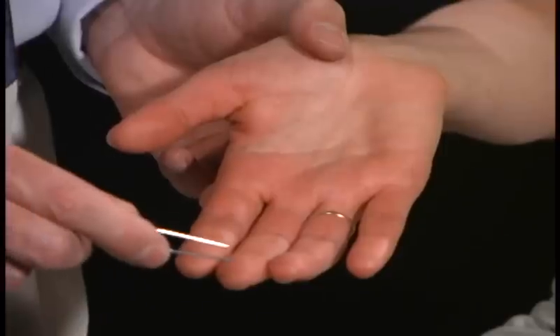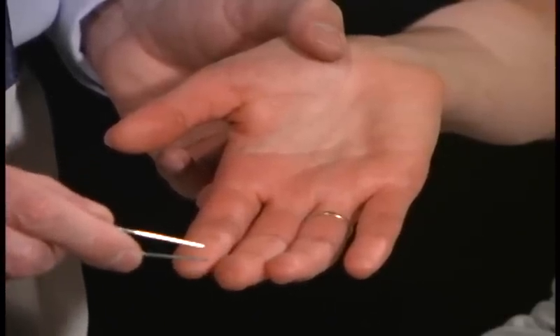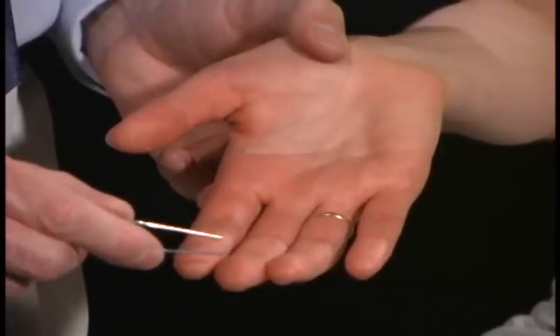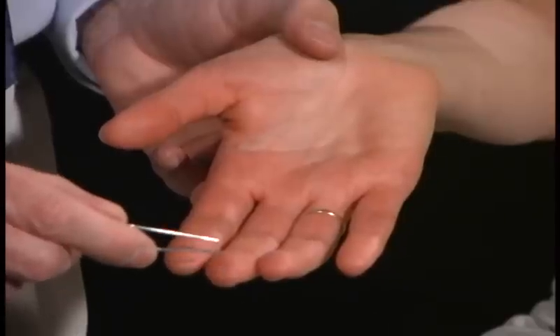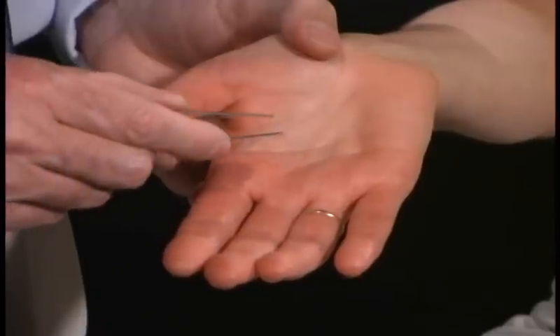For this next task, I'm going to take this caliper and touch you with one or two points. I want you to close your eyes and tell me whether I'm touching you with one or two. One. Two. One. Good. Two. Good. Now I'm going to do it up on the palm.